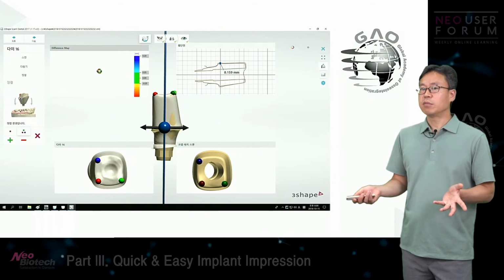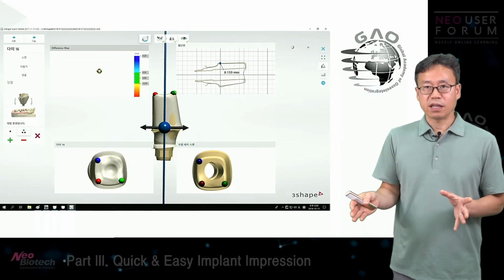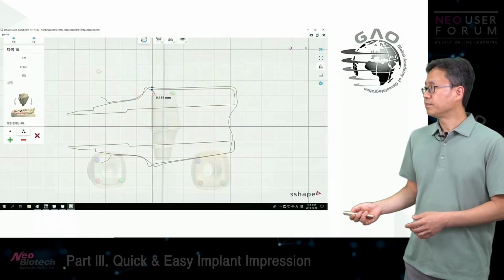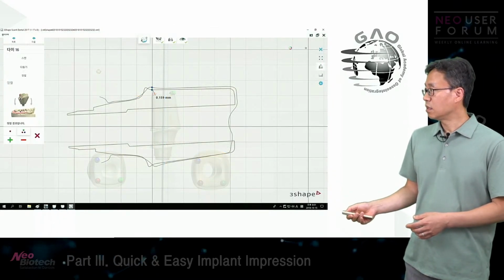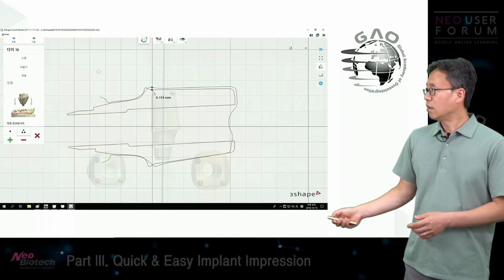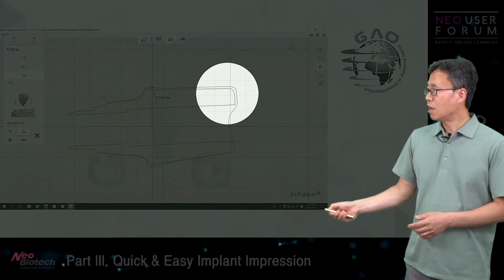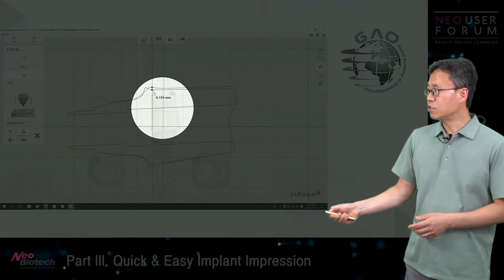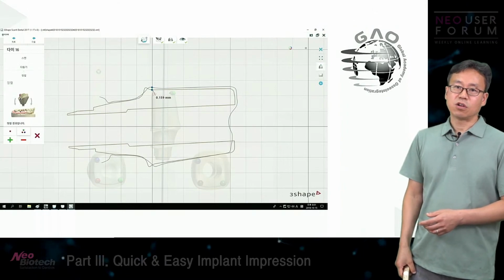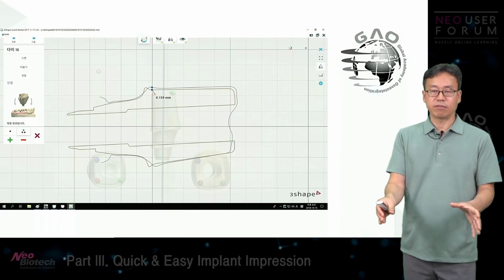This is pretty much why you get these not fitting crowns like this. The scan data of the final abutments are bigger than the original CAD design. So that's why the crowns would not go in all the way down.